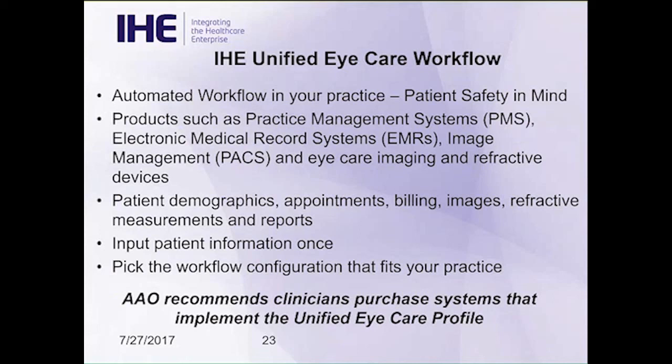Yes, it deals with patient demographics, appointments, billings, images, refraction measurements, reports, and more. We input the data only once, so we have the safety of that information going through. When I register a patient in the practice management system, it flows seamlessly to every other system. But you also need to pick the workflow that fits your practice. Am I Model 1, Model 2, Model 3?